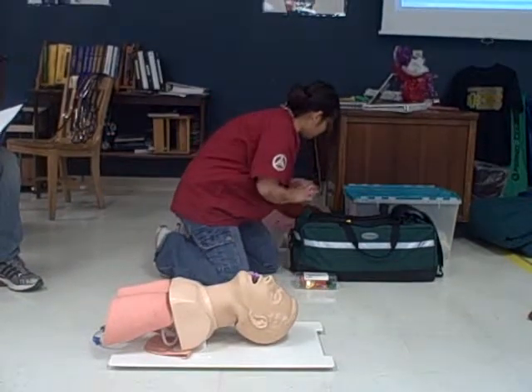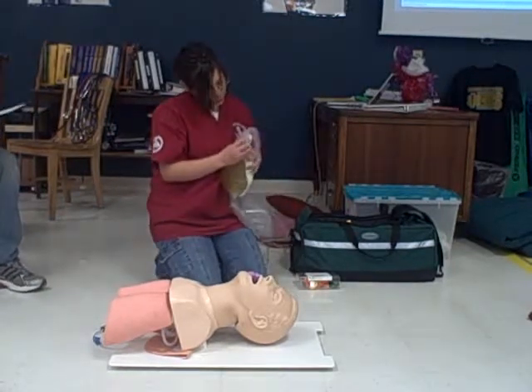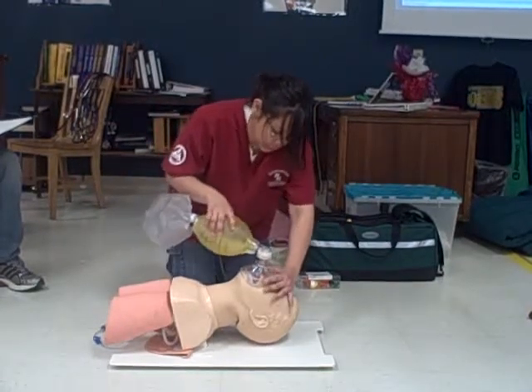Then I will take a proper-size mask. Now I'll ventilate for 30 seconds.